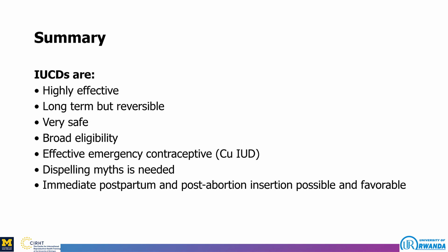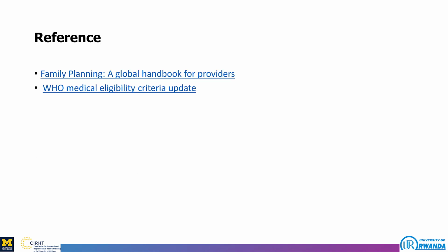In summary, in the first part of my presentation, intrauterine contraceptive devices are highly effective, long-term but reversible, very safe. They have a broad eligibility and are effective emergency contraceptives. Dispelling myths is needed. Immediate postpartum and post-abortion insertion is possible and favorable.